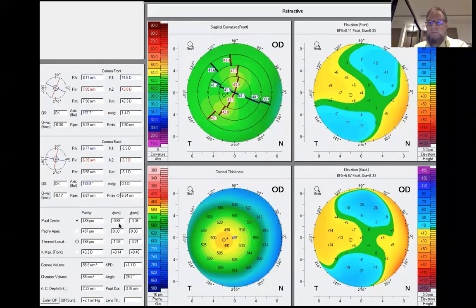Usually angle kappa is best studied by Placido-based devices, but since the Pentacam doesn't have that, there is the Holladay report, which has the chord mu. Chord mu is quite similar to the angle kappa. If you have the old version of the Pentacam software, you will not find the chord mu in the Holladay report.